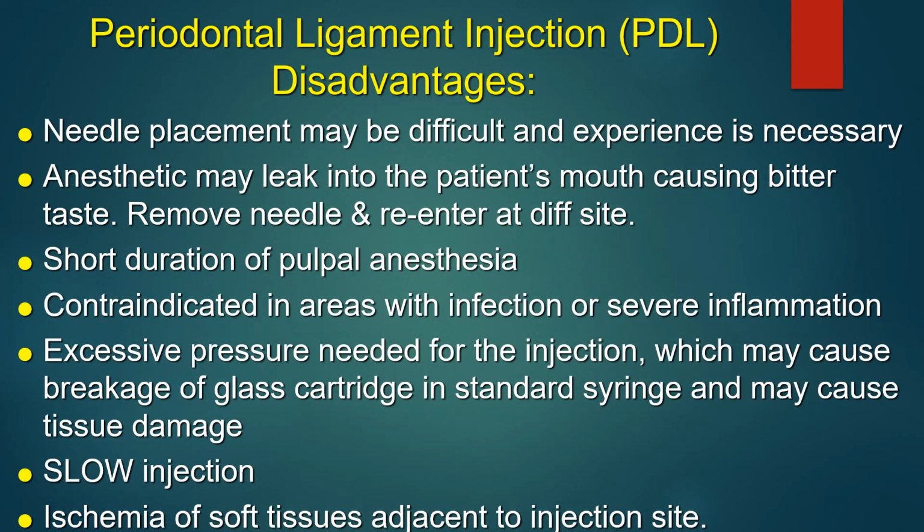Disadvantages: sometimes the needle placement can be difficult, and this takes a learning curve. You need some experience to get really good at the PDL. The anesthetic may leak into the patient's mouth, causing a really bitter taste. They don't like that, and you have to remove the needle and re-enter at a different site. There's a really short duration of pulpal anesthesia with this, and you could tell because if you're only giving a stopper full, it's not going to last real long.